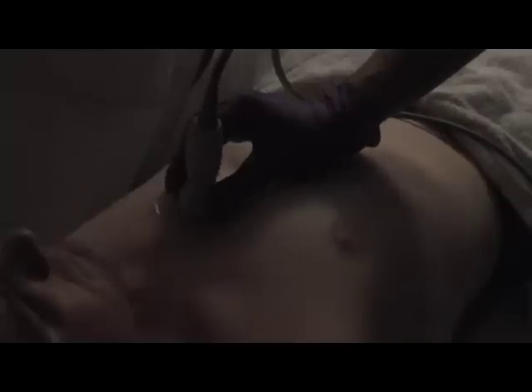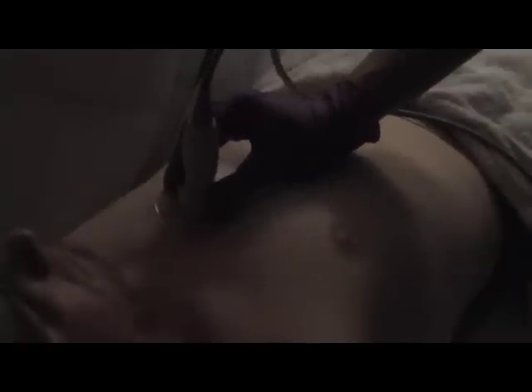On many images, you can sweep the probe and look for the descending thoracic aorta. It will be a circular anechoic structure that will be posterior to the left atrium.